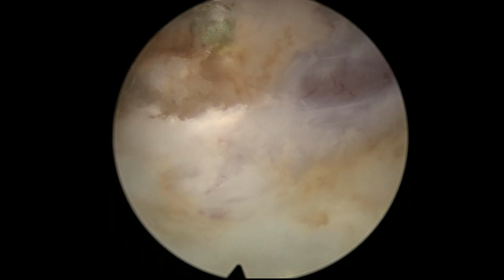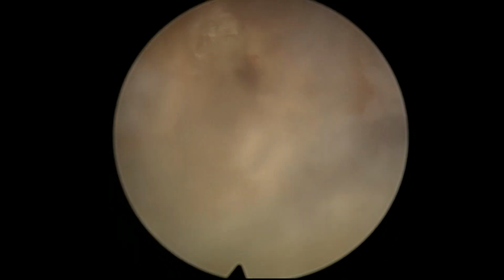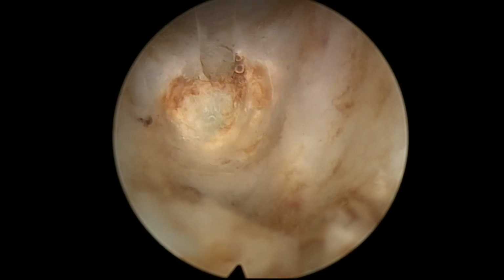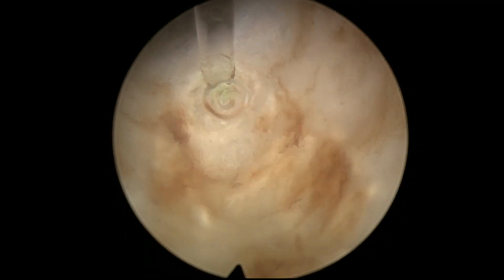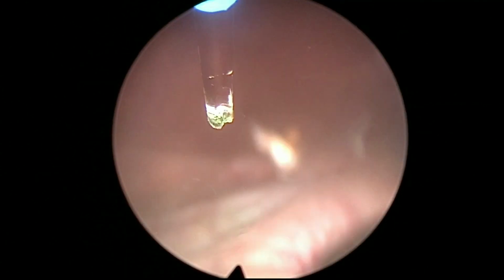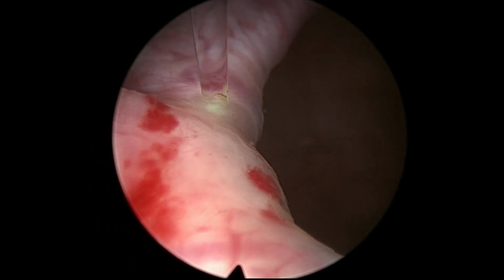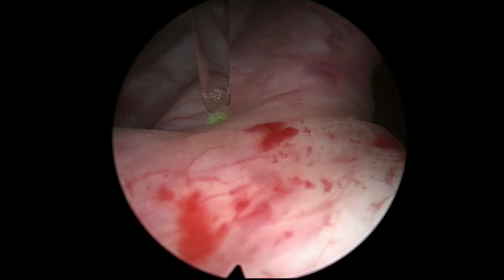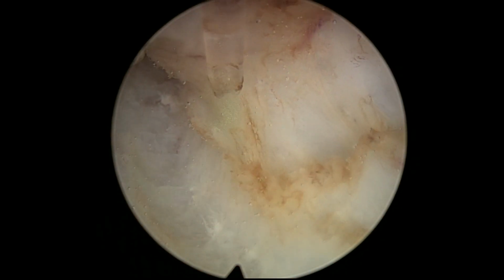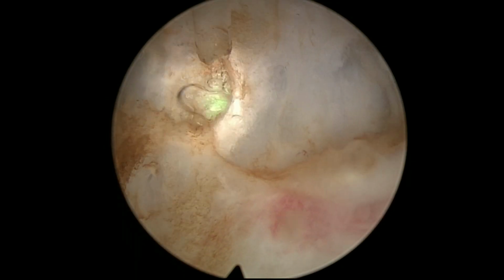We did a session with many cases. I have recorded a lot, so I will try to post more videos. And the reaction of my nurses was total enthusiasm because of the quality of the hemostasis. So wonderful, really. But as we progressed with more and more cases, they had their doubts. So I think it's a difficult call for all of us to choose our tool. I mean, what would be our favorite tool?